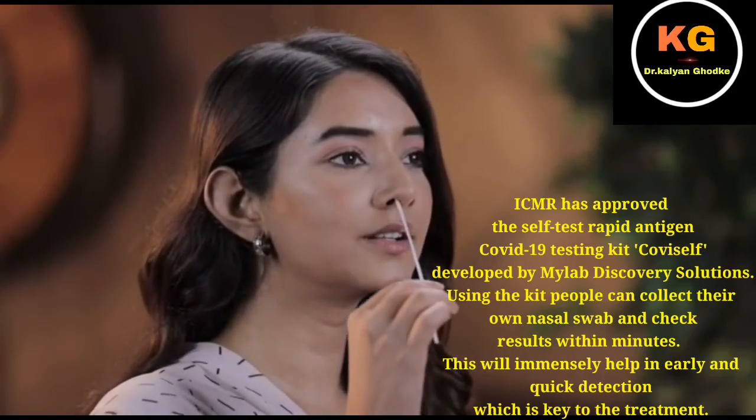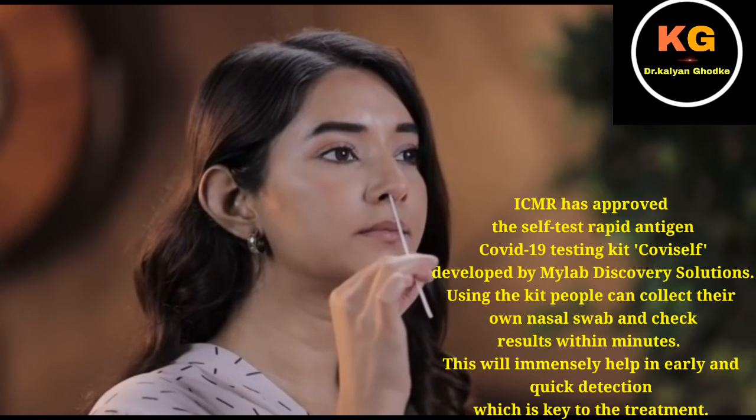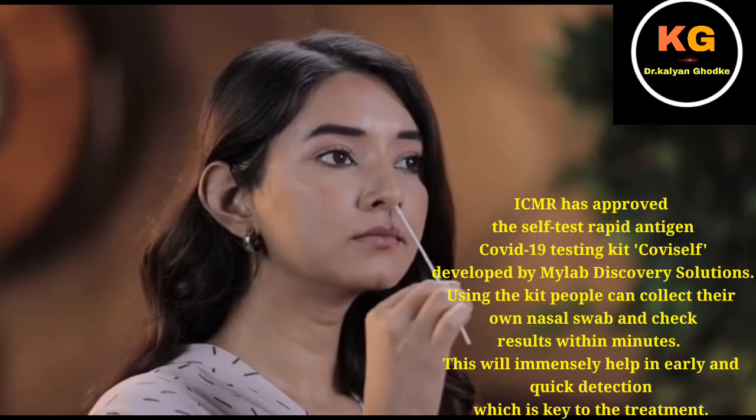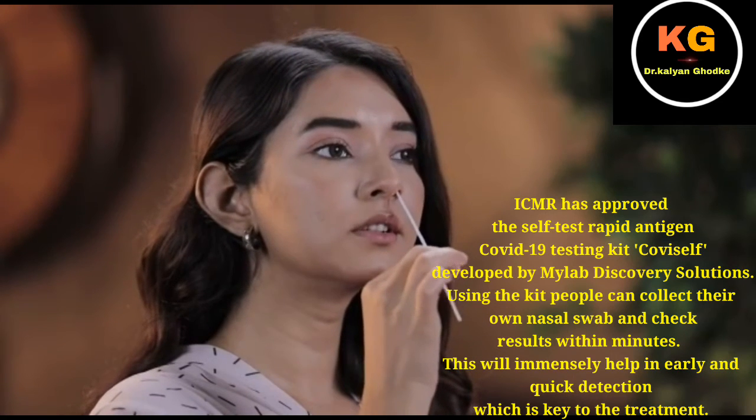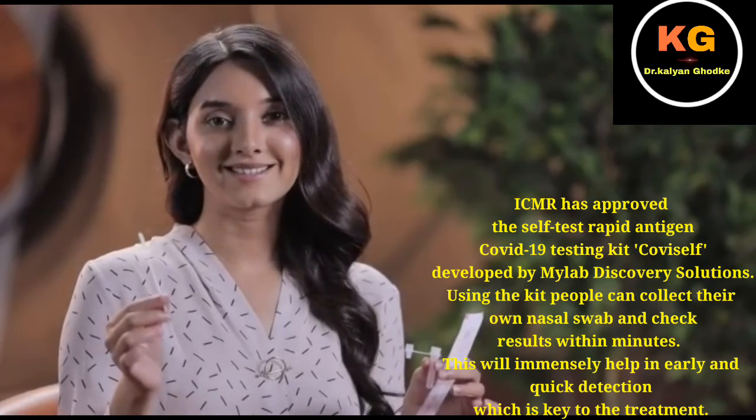Carefully insert the sterile nasal swab in both your nostrils, one after the other, up to 2 to 4 centimeters or until resistance is met. Roll the swab 5 times inside each nostril. Your nasal swab is now ready for the test.